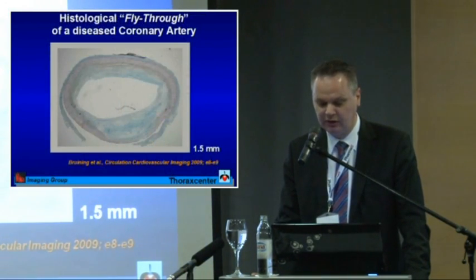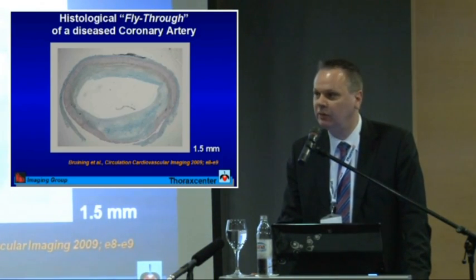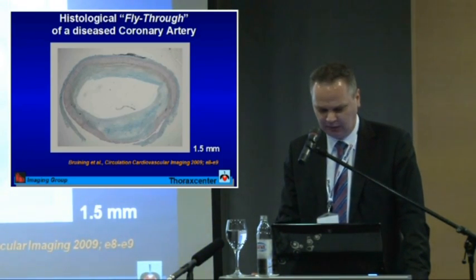Now if you watch this video, you can see that we have remodeling, you can see the vessel is growing here. Even the plaque will rotate in a second. You see the lumen will also change in this 1.5 millimeter only. And here you see some necrotic parts coming in. And also some calcification will come in.